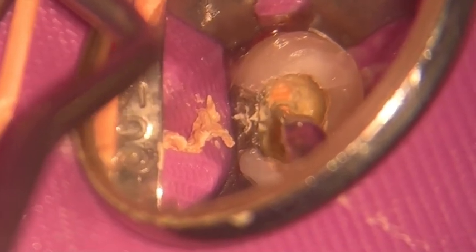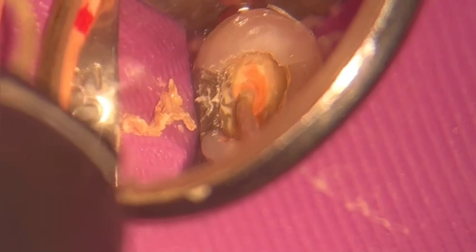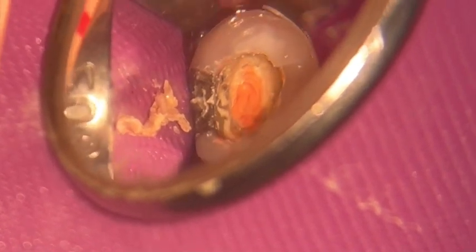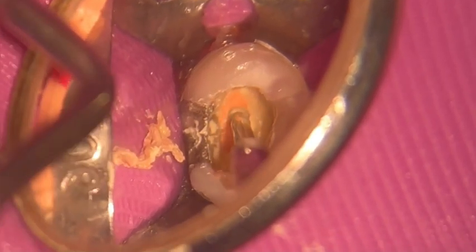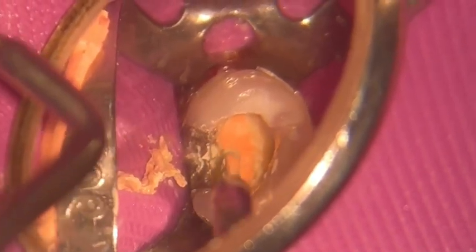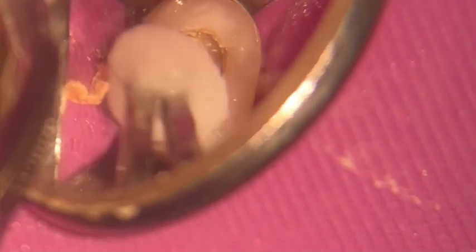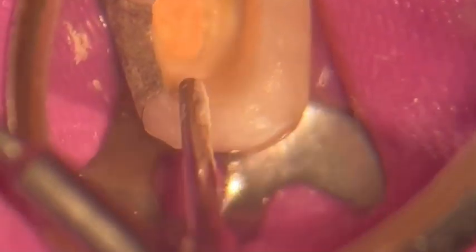Remember to compact pretty well — do a good job with this. Just take your time at every step of the treatment, because if you try to rush one step it's going to backfire — 100%. Do your protocol, follow it, and you'll get to the end of your root canal with no problems. I'm using alcohol here to remove that resin-based AH Plus. With bioceramic sealers of course you can just wash it off, which is amazing. But in this case, alcohol gets everything really, really clean as you can see.